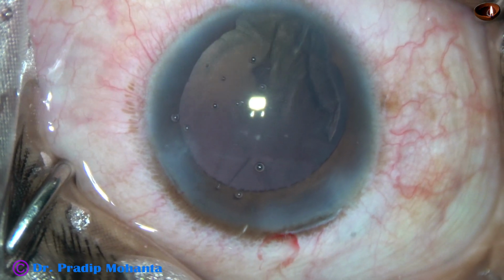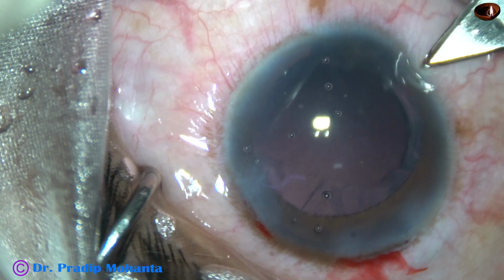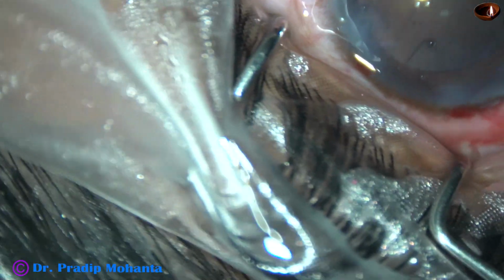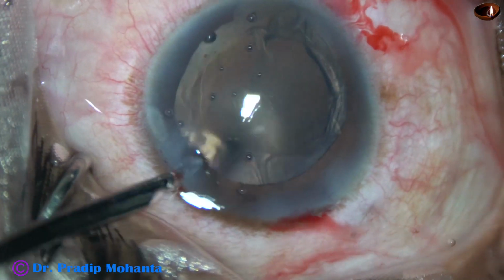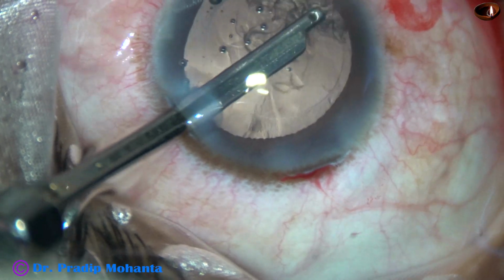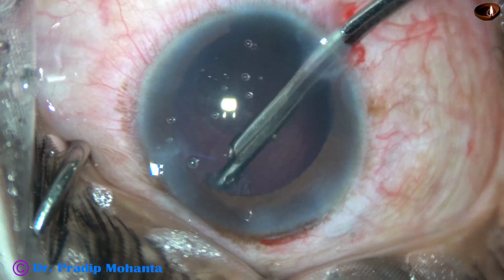I want to fill up the anterior chamber and bag again with visco, and then I'm making one more side port at 7 o'clock. There was only one side port till now, and now there's another reason to make this side port at 6:30 or 7 o'clock. We're going to see that in a short while. So the cortex from the right side is being removed. Now I go through the 6:30 o'clock side port and remove the cortex from 12 o'clock.